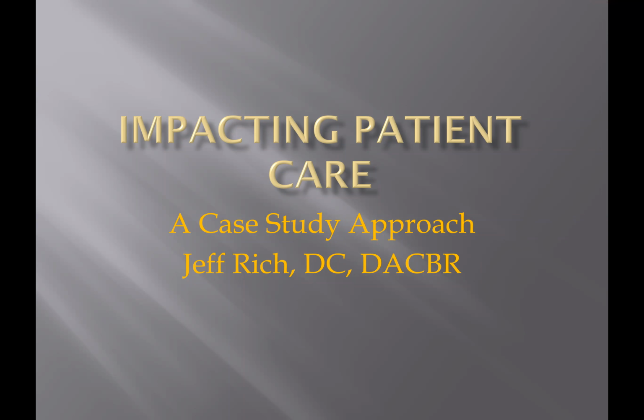Well, thanks, Jeff, for inviting me. I'm excited to be continuing to do these lunch and learn radiology case study times with you guys. These are all fresh cases. A lot of them are so fresh I don't even have follow-up imaging, but this time is designed really not to pound lots of information at you, but to just show you some really interesting cases, get some discussions going, and almost be a hands-on radiology workshop for you. So I'm excited to get your feedback on some of these cases.